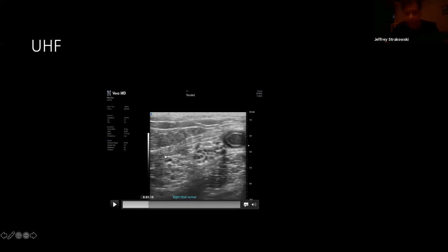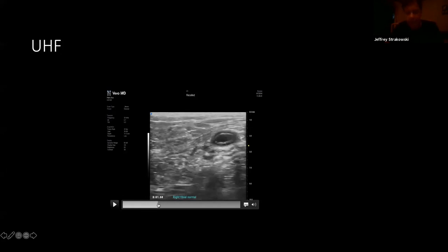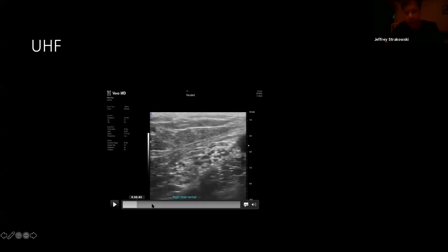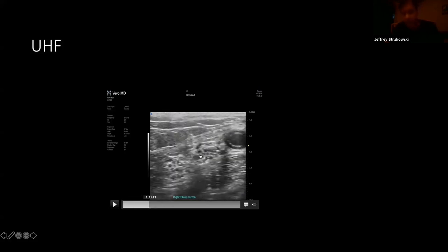And if we just use a set measurement of this whole cross-sectional area, the further distal we go in the tarsal tunnel, the bigger, obviously, the cross-sectional area is going to be, and some of it may be artifactual. So we have to be very careful when we're just trying to use ordinal numbers in a very complex regional anatomy.